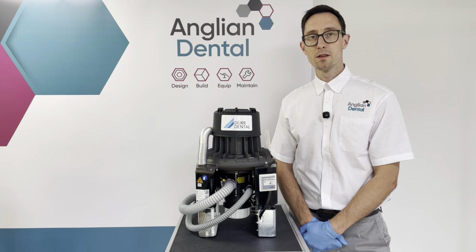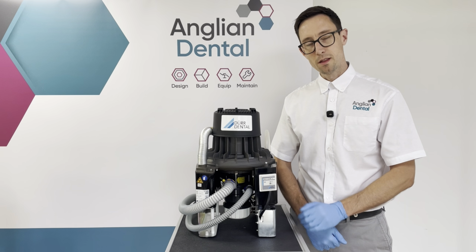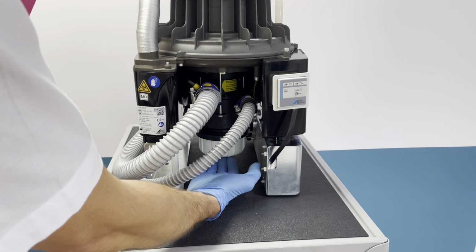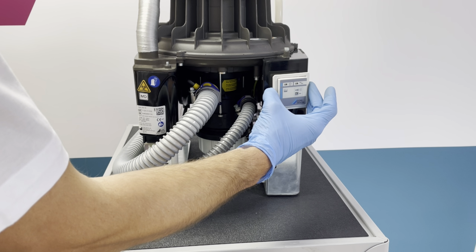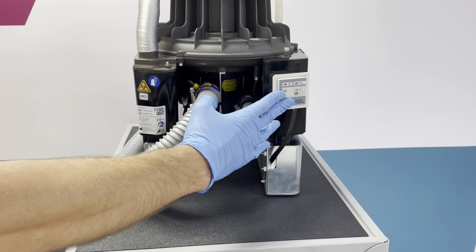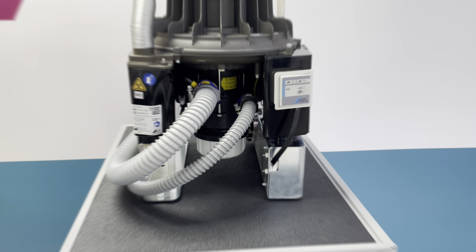Today we'll be talking about the single surgery vacuum system from Durr Dental, which is the VSA300. In this video I'll be talking you through how to replace the amalgam collector vessel on the Durr VSA300. The machine will tell you when the pot's ready to be replaced by a 95% full alarm and a 100% full alarm. I'll put the sequence on screen now.